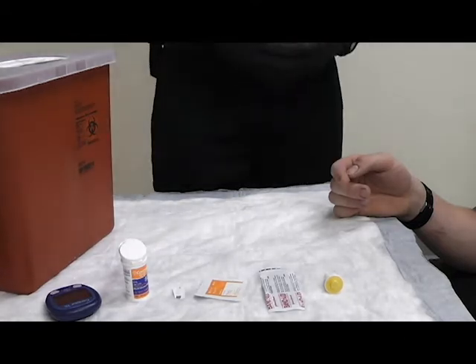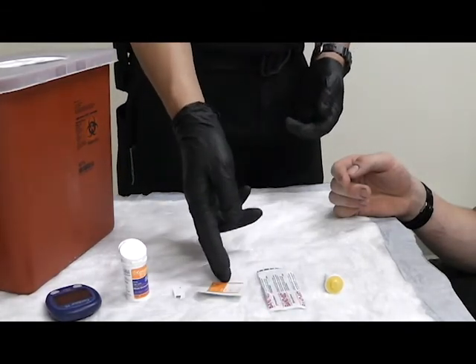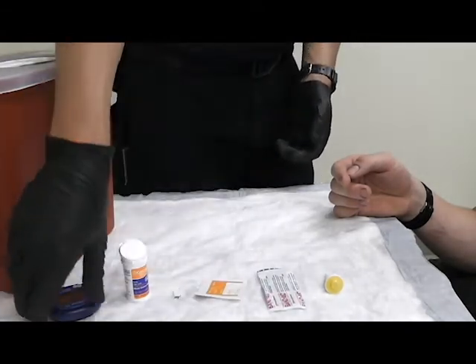After I've gotten permission from the patient, I'm then going to prep all my equipment. I need my lancet, bandage, prep swab, testing strips, and my glucometer.